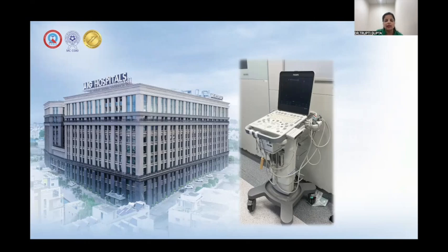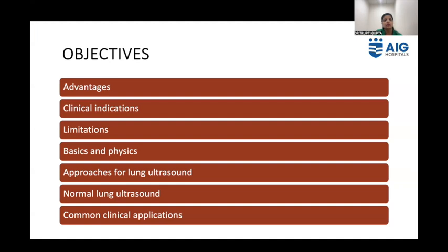Without any further ado, I would like to start my tutorial about the lung ultrasound. So the objective of this tutorial is to cover the topics, that is advantages, clinical indication, limitation, basics and physics of ultrasonography, approaches for lung ultrasound, normal lung ultrasound, and common clinical applications.